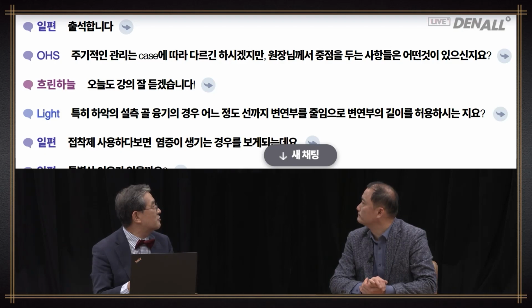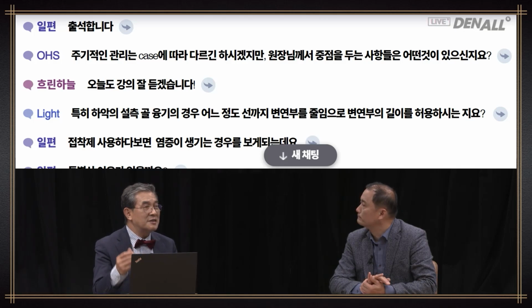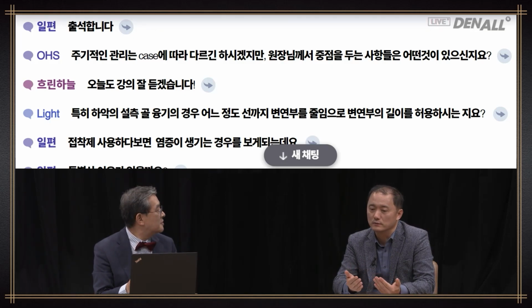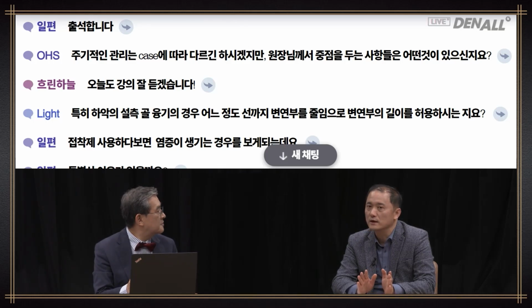OHS asks, regular maintenance would depend on the case and would be different by case, but where would you focus? So what's your focus, I guess, in a recall check? Very similar to the topic of today. It's all about retention and stability. And I think patients feel it first. I mean, they say it has become loose or it's painful.